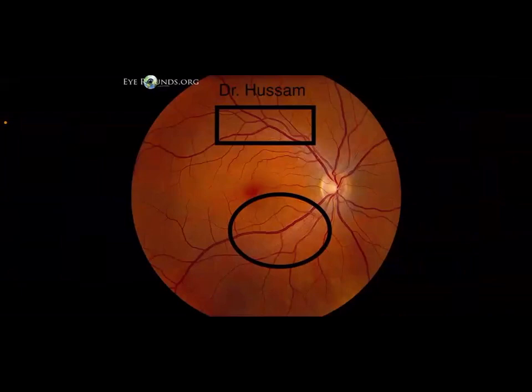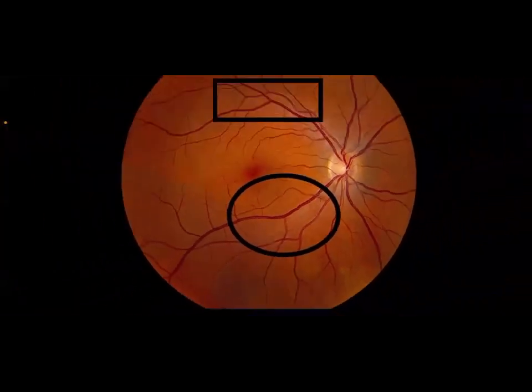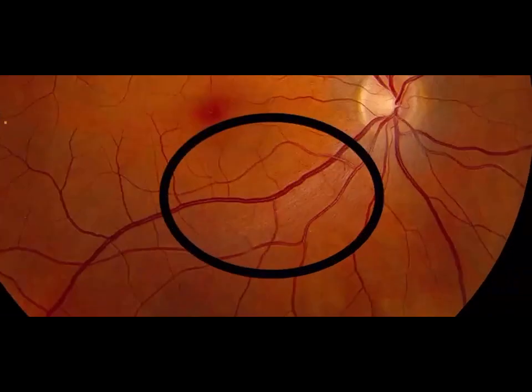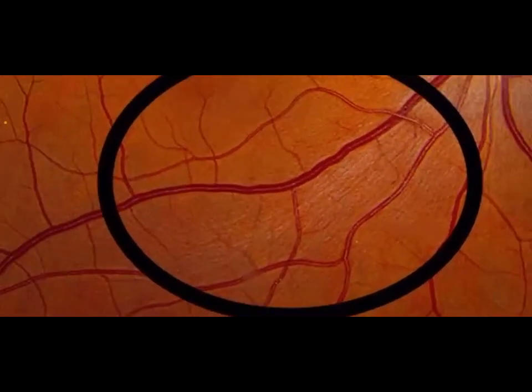You will land on one of the retinal vessels. You will not see the whole picture, not like in Zoom, where they give you the whole picture. No, what you will see is something like this. For instance, are you able to see the screen? Yes, sir. So you will find yourself landing on an area where you do not know whether it is lateral to the optic disc, medial to the optic disc, above, or below. So in order to reach the optic disc, you will try to localize one artery.